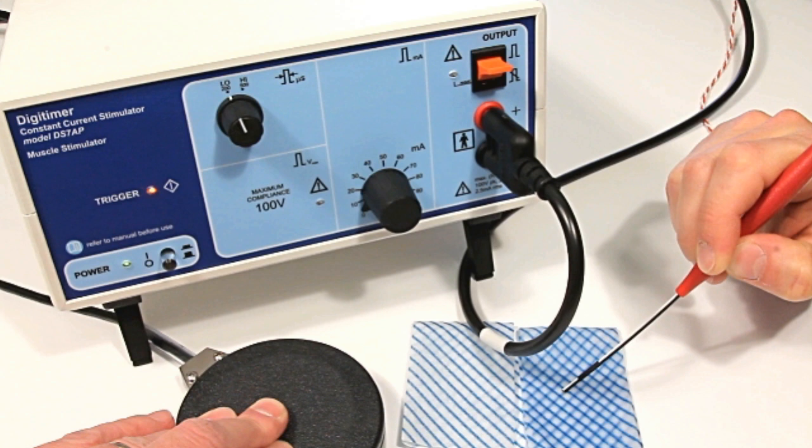To prevent out of compliance events and a subsequent failure to stimulate, it is imperative that the surface being stimulated is swabbed and moistened with saline prior to stimulation, as this will help maintain a low resistance pathway between the probe tips.